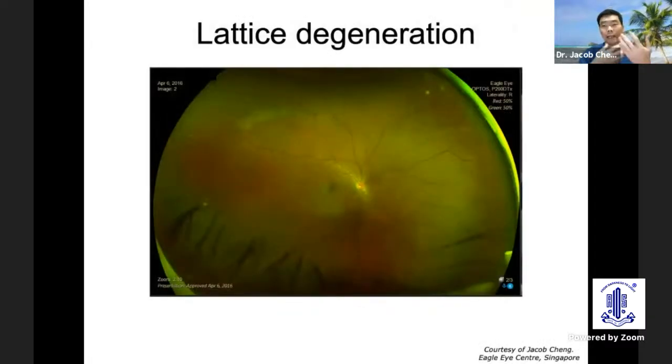So this case would be both instructive as well as, in this day and age of medical legal prevalence, we need to document that we have actually counseled the patients with photograph. However, patients would like to delay treatment and subsequently develop complications. It's also important to document with the opposite eye some lattice degeneration to predispose the patient to retinal detachment, as the earlier speaker has also mentioned.